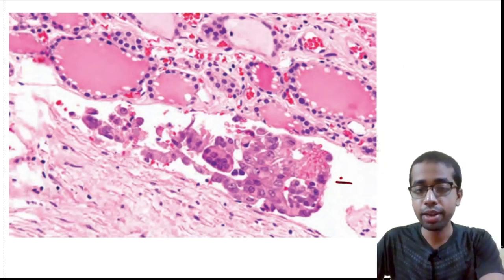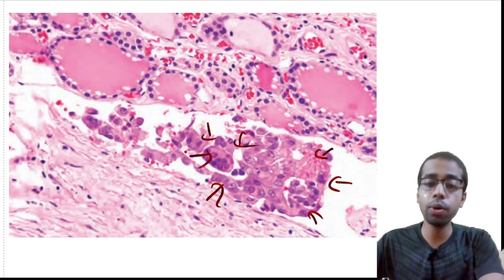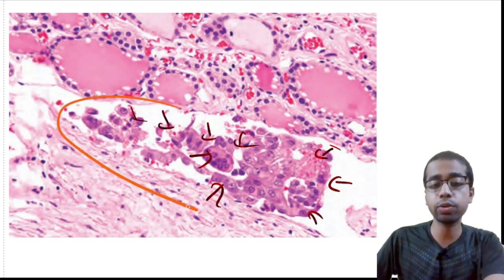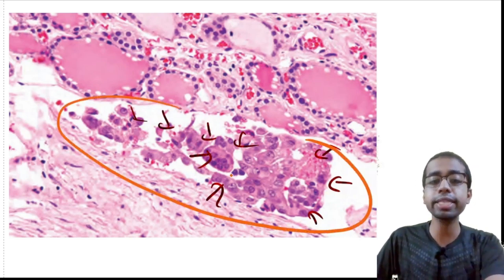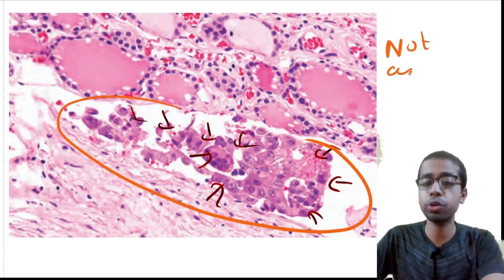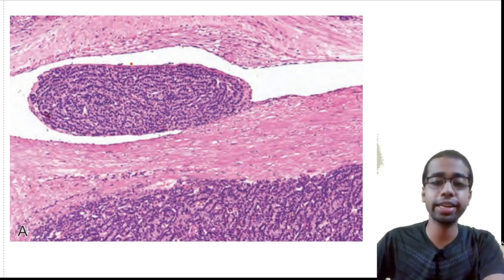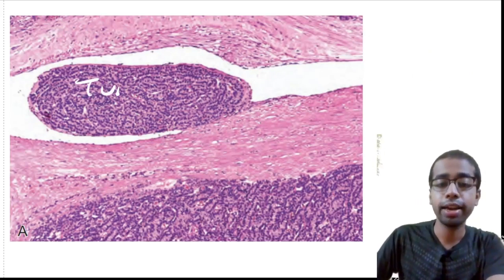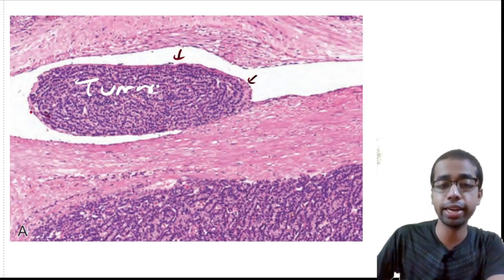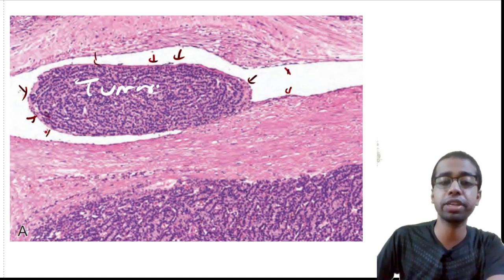Okay, here we have some tumor fragment, follicular adenoma, neoplastic follicles, and now you can see this large one is a vessel. But is the tumor portion lined by endothelium? Answer is no. If no, it is again not an angio invasion. Understood? Okay, here we get the tumor part, and the tumor part is also surrounded by this structure. What is the structure? Endothelial lining. The same lining that is surrounding this vessel is also lining the tumor. That's an angio invasion.